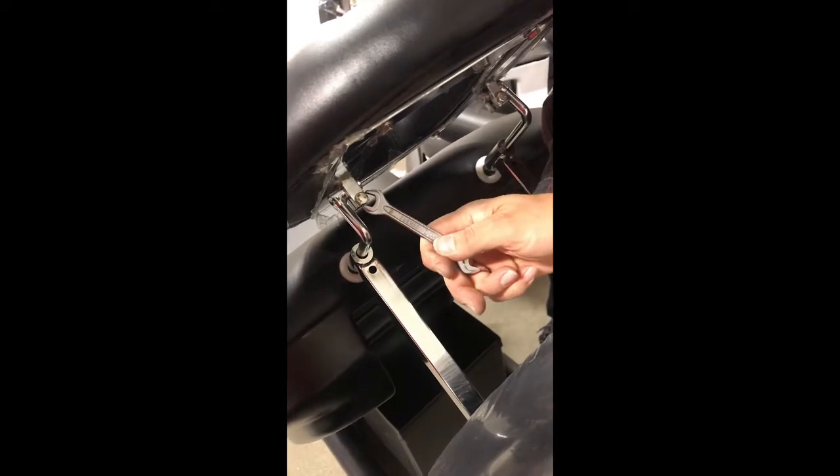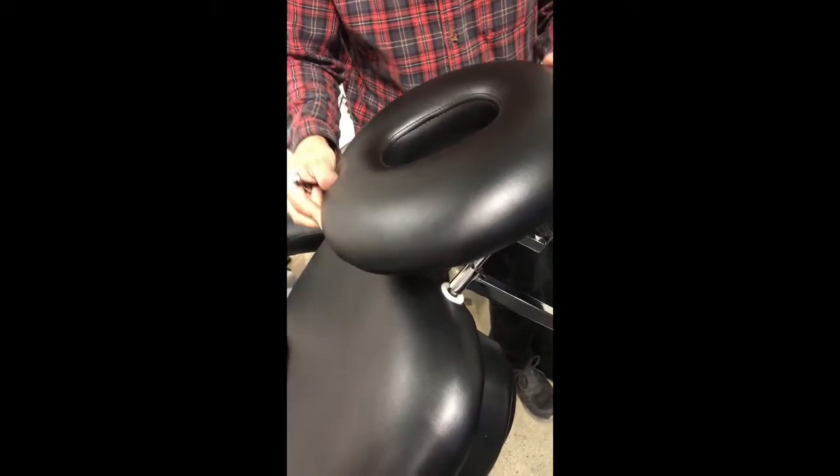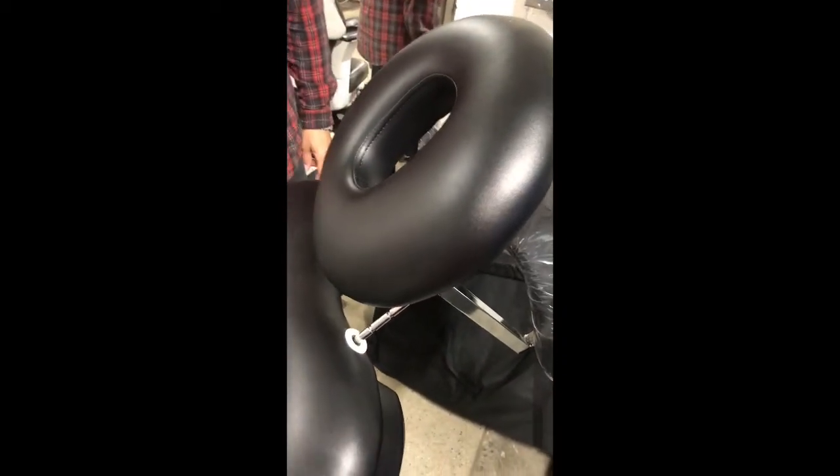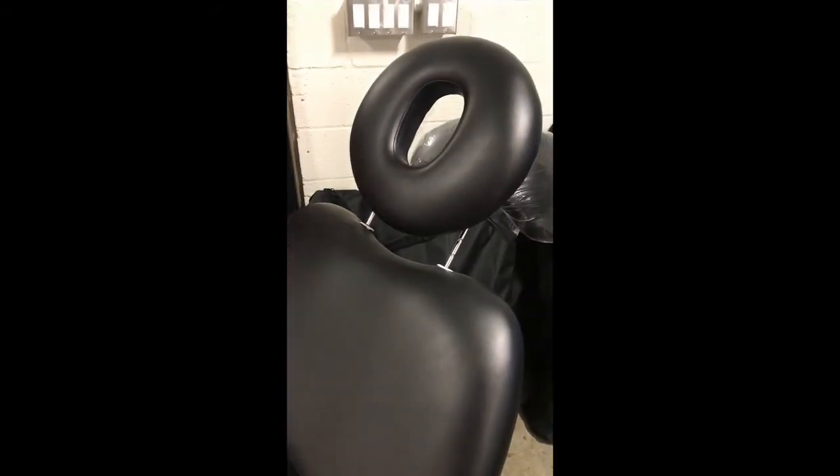A little bit will do the job and you can adjust the headrest. With people resting their head on it as well, you can get that angled up. And that's how you loosen the headrest for the Monet.